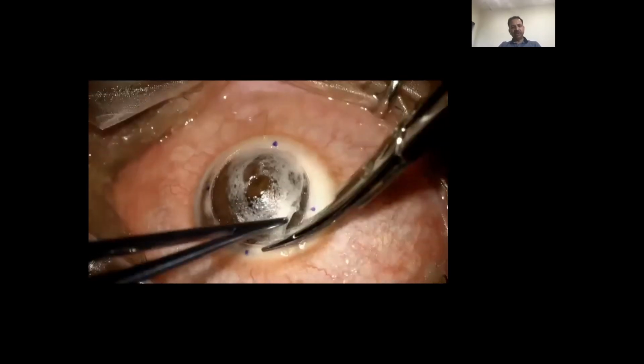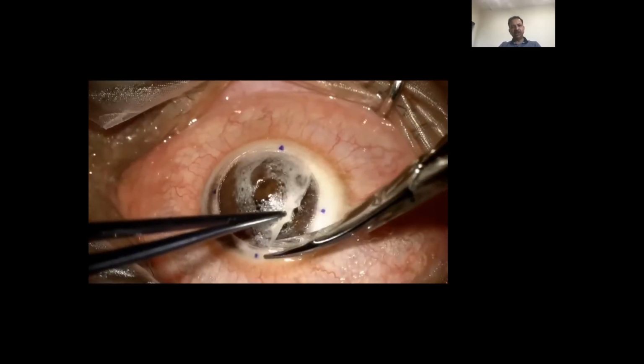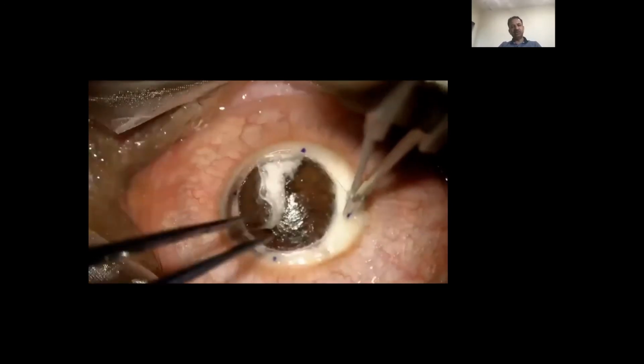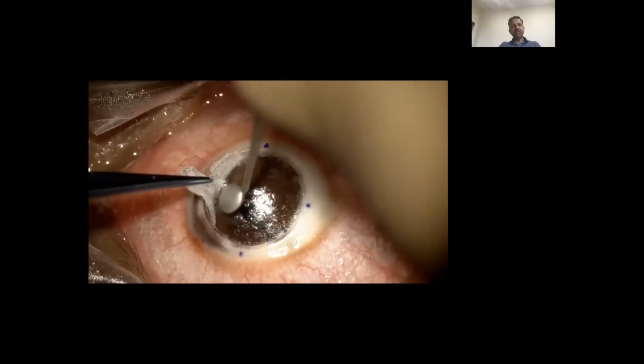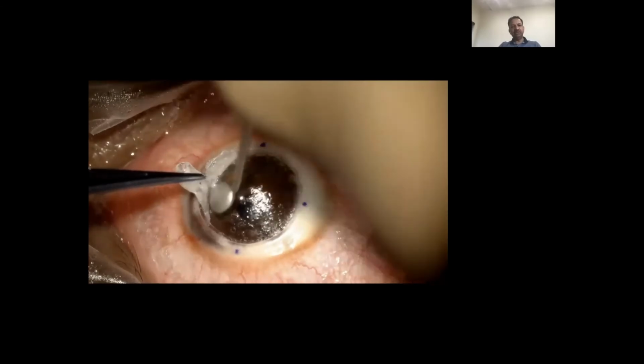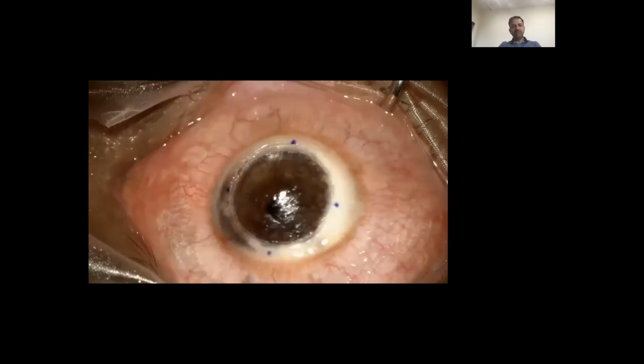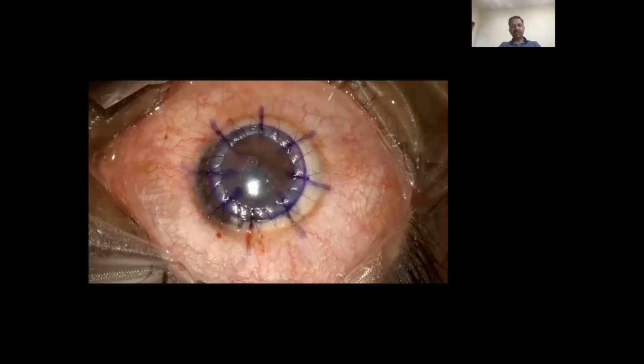Now, this is a manual technique, so we tried air injection, it did not work. So in the periphery, we go and create a plane of separation. And the central part is pretty much similar to what has been described by Enrique Malbran. That's the Malbran peeling technique. If you're at the desired depth, you will find that you don't need to dissect too much in the corneal apex. It just peels off on its own.